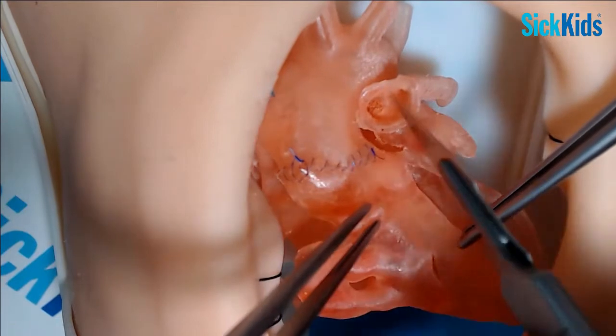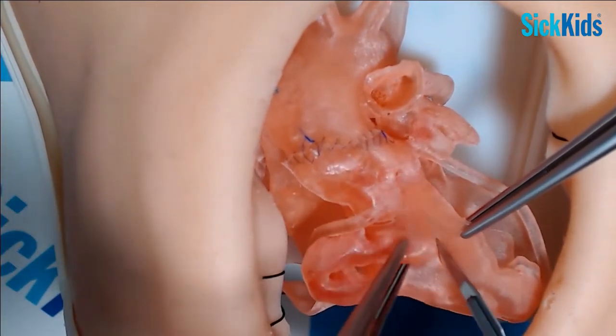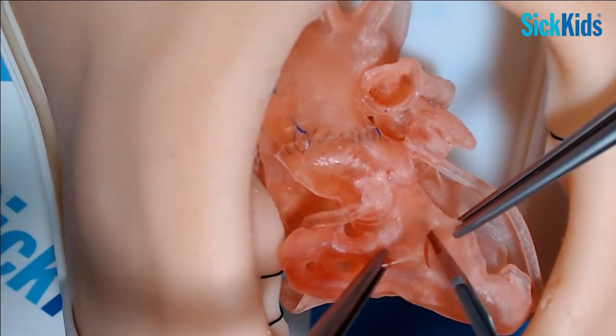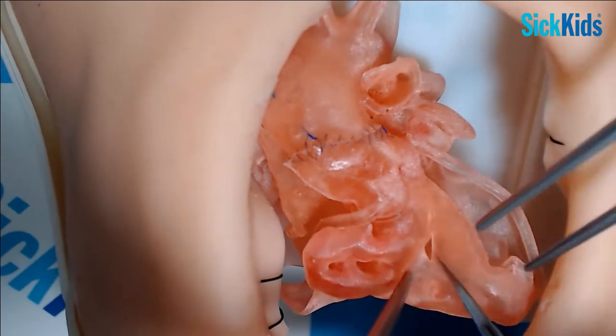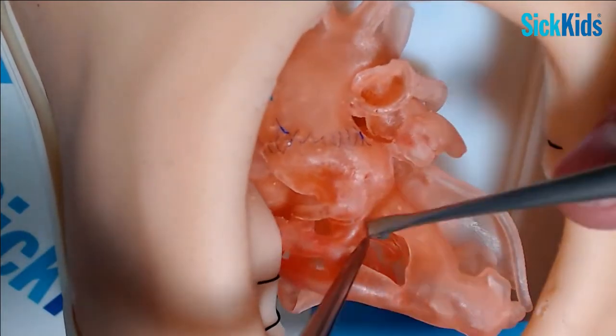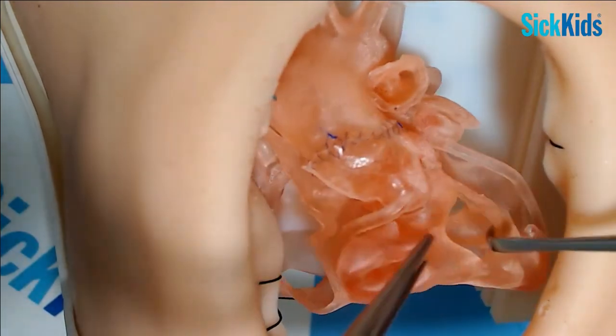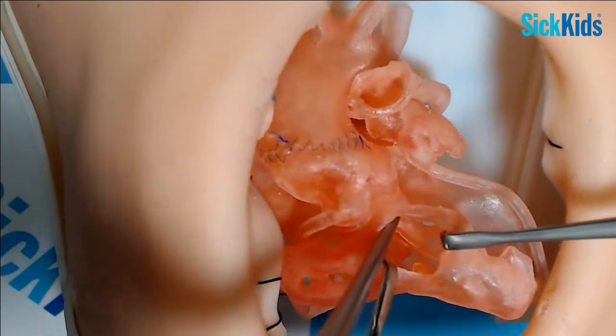And you know the conduit's going to go this sort of direction, so you try and make your ventriculotomy roughly in the same orientation as your conduit. Yeah, and then you can get a good look inside to have a look at your VSD, which I hope is here. Yeah, so there you are.